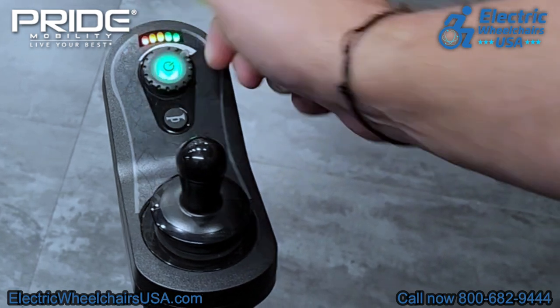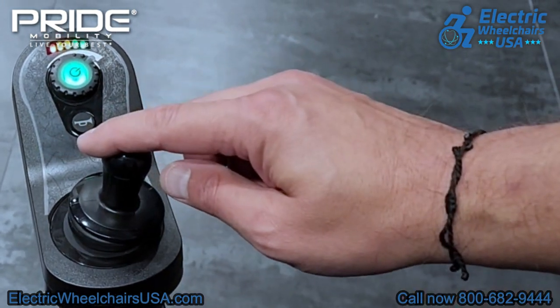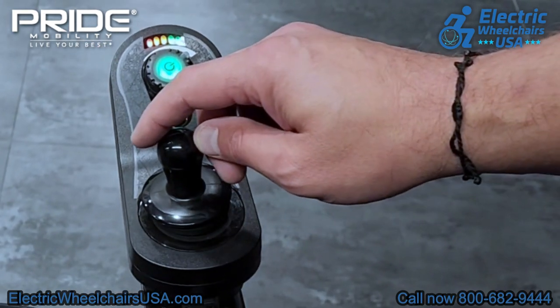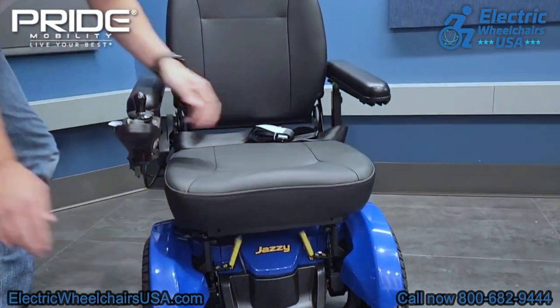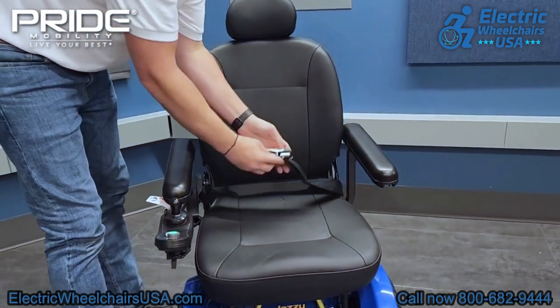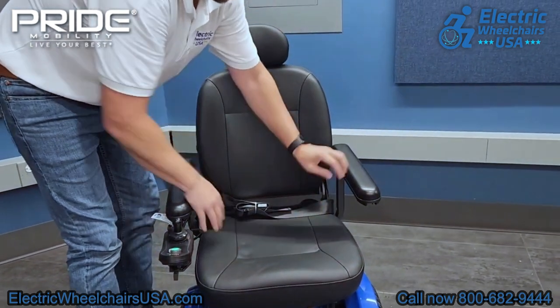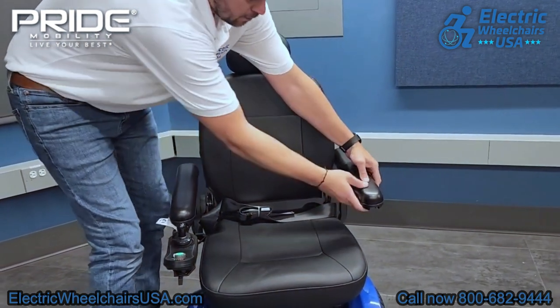This button underneath is your horn button. The joystick is very smooth and intuitive. The seat on this chair is super comfortable — it comes with a seat belt as standard, is really padded and cushioned, the seat back is padded and cushioned, and the armrests have some cushioning on them as well.